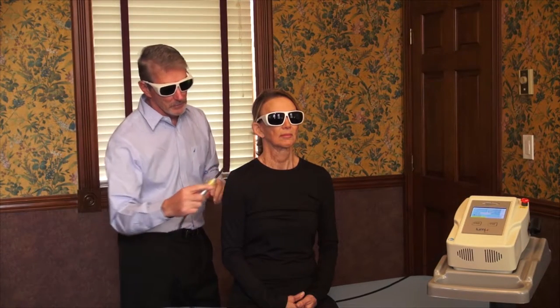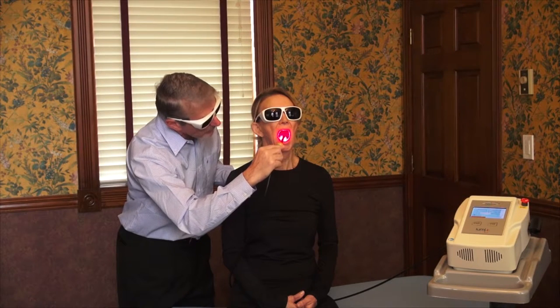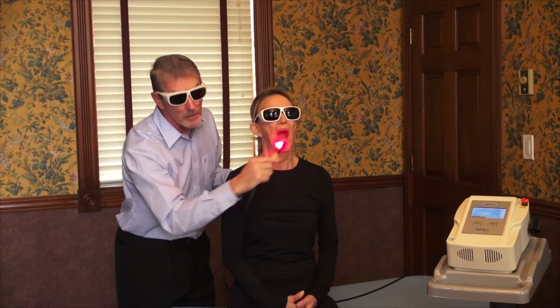When switching to treating from the inside, we simply use the dental tip. I would be in an optimal position and treat accordingly along the gum line. Typically you don't need to spend more than 15 to 60 seconds in the oral cavity for most conditions. In the case of treating the TMJ, this tip would not be recommended because its beam is too narrow to cover muscular areas.